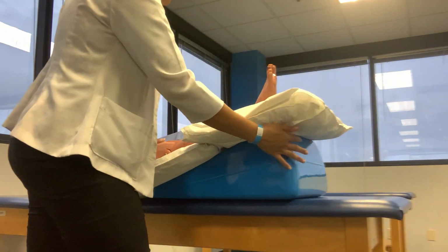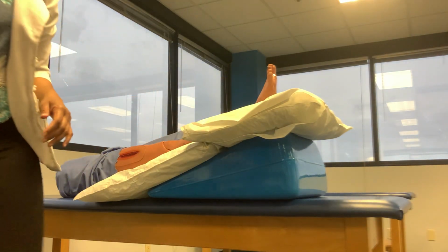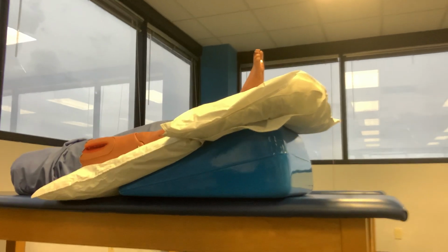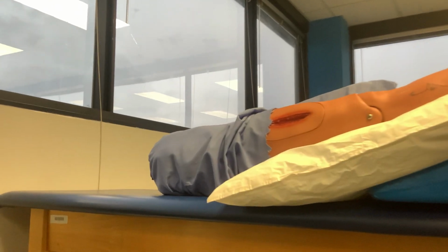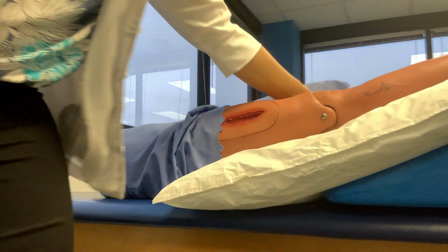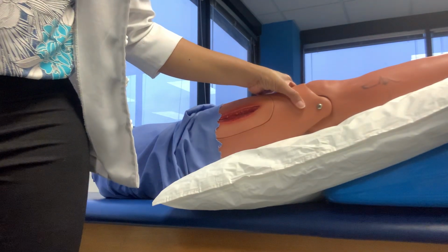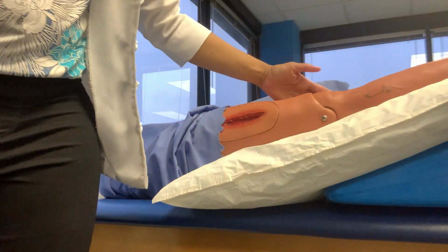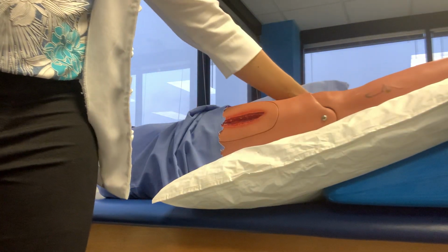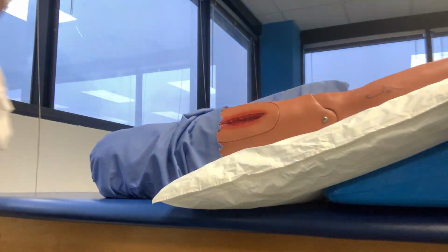So once I've gotten the wedge underneath, and I basically have a nice level leg, I'll bring you in a little bit closer, because what you're looking for is that elevation of the limb, but you also want to make sure that the knee's completely straight. Because if we have any knee flexion and there's space under there, remember that's the open packed position of the knee, and it will allow any accumulated edema, as you're getting it to flow down, or I should say up the leg, to pool in that area. So you want to limit the space that you have for any edema to settle in.